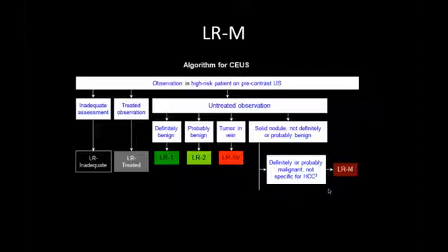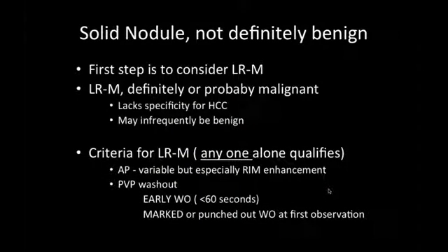Here's a patient with a very fatty liver and a focal, well-visualized hypoechoic mass. This is an elderly woman with NAFLD. Now, when we look at this in the arterial phase, we can see that at 23 seconds, the grayscale image on the left shows our black lesion, and we can see on that image on the right a poorly enhancing liver, but with a rim enhancing lesion. And here we can see the value of the dual screen, where we can place the calibers on the lesion for precise localization of the enhancement that we view. And we can see the rim enhancement of this lesion.